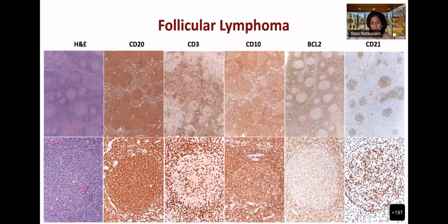Okay, so there is a lot of fancy immunohistochemistry that you can do, and this is not even all of them, but I have just summarized what you would typically want to consider doing. You don't need all of this. You guys were already able to make the diagnosis on very few things. This particular one actually has dim BCL2, as you can see here. Be very careful when you evaluate BCL2 in that you should always look at a CD3 to know whether the BCL2 signal is coming from T cells or from B cells. So when you don't have a bright BCL2, it is very important to compare with CD3, because T cells are normally BCL2 positive. We talked about a translocation. The protein BCL2 can be expressed without the translocation. So it's positive in normal T cells and it's positive in a lot of other things that are not actually helpful or may even get in the way of the diagnosis.